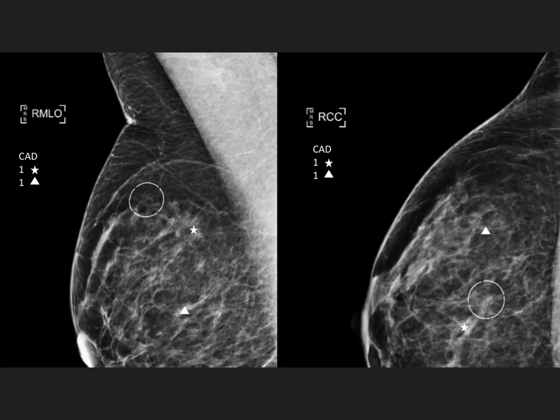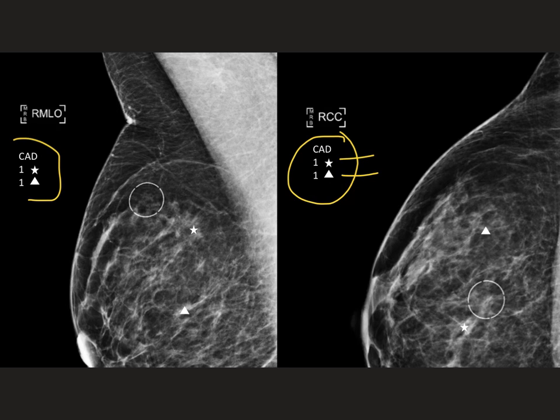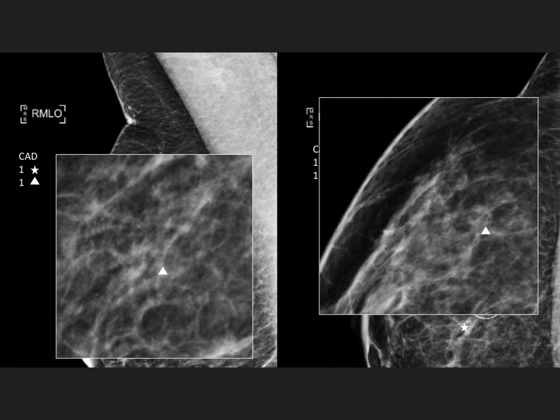My next screen shows the right MLO and right CC views at full, highest resolution, and also with the CAD markers on. Most systems use some form of computer-assisted detection and show the count of lesions identified on each image. On this particular study, they identified one asymmetry — those are stars on this system — and one triangle, which represents calcifications. I interrogate each of those identified areas to see if I believe it's a real abnormality or not. There are many, many false positives, unfortunately. In this case, I've decided the calcifications and asymmetries are not significant, and I move on with my systematic review.